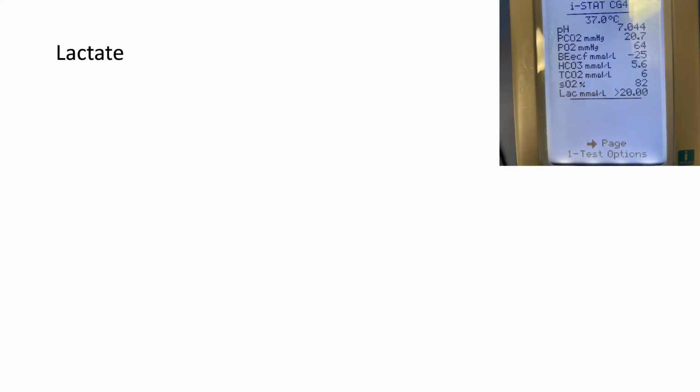Let's talk about lactate for a sec. If you look at this patient's lactate, it is really high. The machine doesn't measure above 20, so it just tells you it's more than 20. So what is lactate? It's the conjugate base of lactic acid. We all produce it. We're all in kind of a steady state. So it's constantly produced from pyruvate. When you do a gas, you never see a lactate of 0, even in healthy patients.